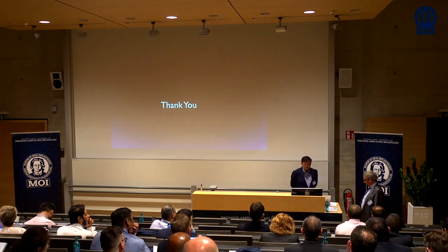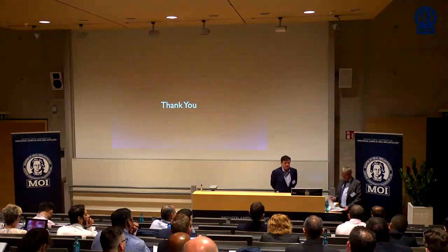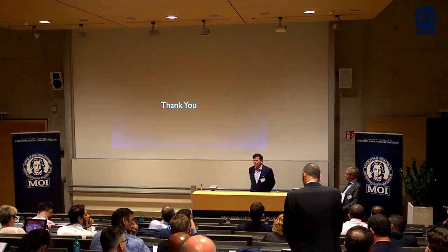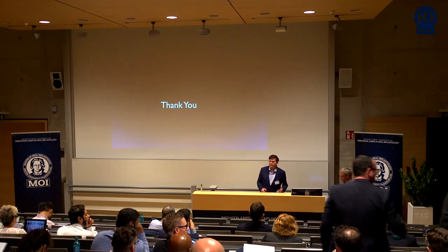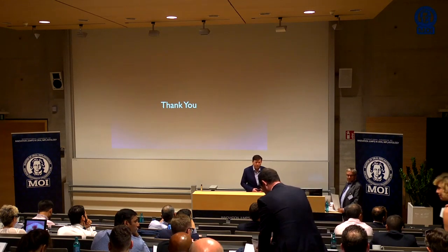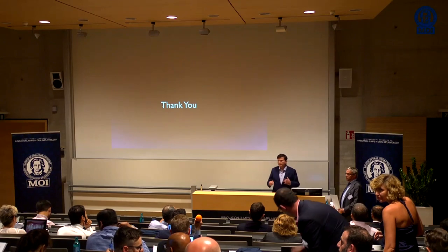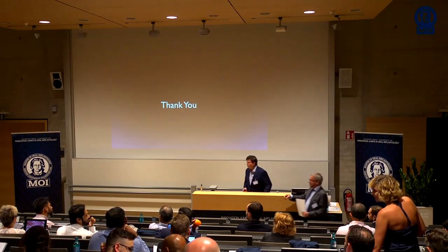Very good question. I knew somebody was going to ask that. It can be anything, really. I've been using monolithic zirconia now. With veneering ceramics, that's one of the complications with any workflow like this full arch zirconia workflow, because mechanical failures happen. If you put veneering ceramic on these, then you can chip the porcelain. The alternative would be to use a high translucency zirconia, but because of the crystalline microstructure, those are maybe a little more prone to breakage too, because the crystal lattice is more organized and more prone to fracture.